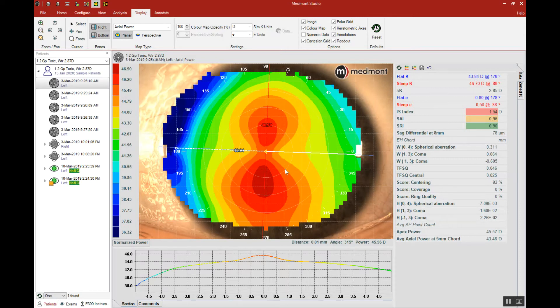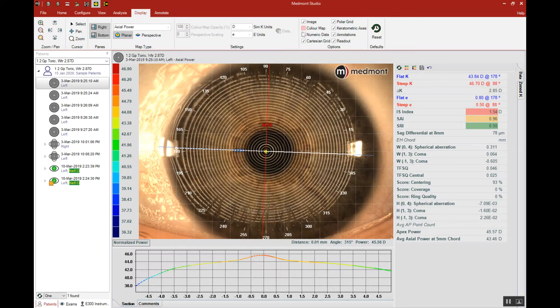The first step is to be able to make out the pupil itself. To do that, go up to Display and uncheck the color map. Then you're able to see the photo behind and we can therefore define the pupil.